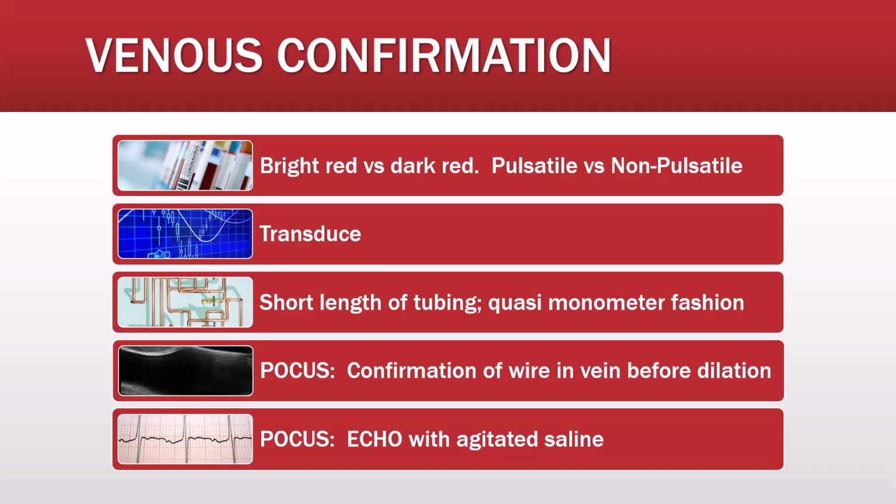Very similar to old school central venous pressure manometer reading, you will expect the venous cannulation to oscillate and hover, not exceeding more than 10 centimeters. If the insertion needle is in an artery, the arterial hydrostatic pressure will exceed the 10 to 15 centimeter distance in that tubing, and it will be seen in a pulsatile fashion, confirming the unfortunate inadvertent arterial cannulation.